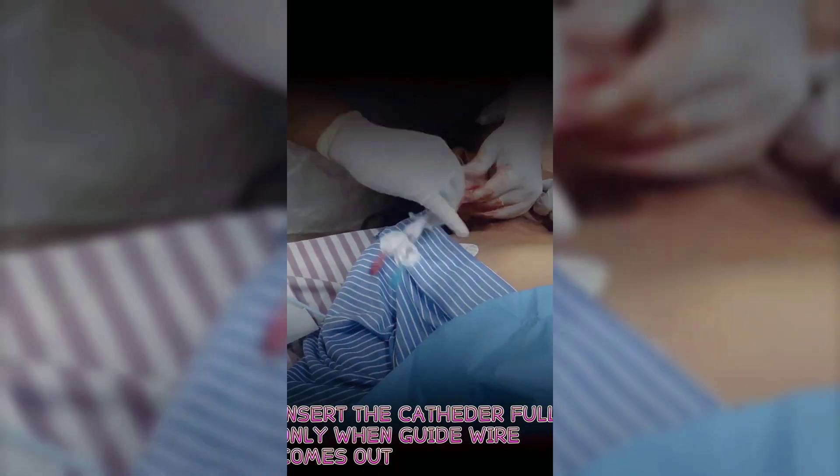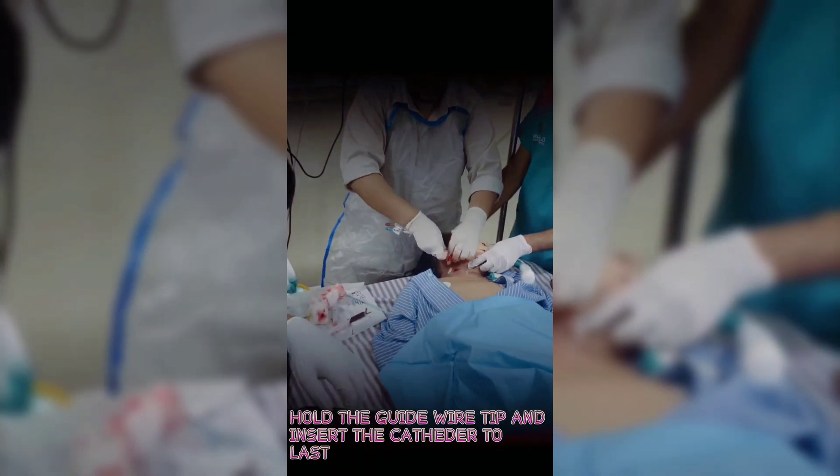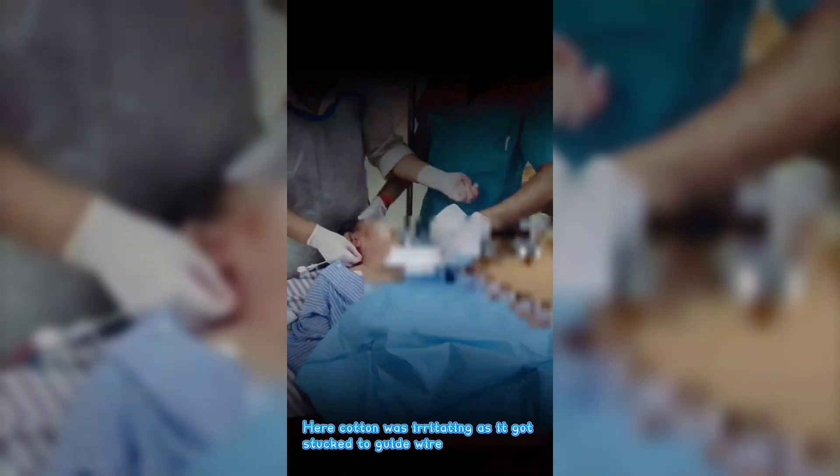Insert the catheter fully only once the guidewire comes out the other end. Hold the guidewire tip and advance the catheter to its full depth. Note: cotton was causing an issue here as it got stuck to the guidewire during the procedure.